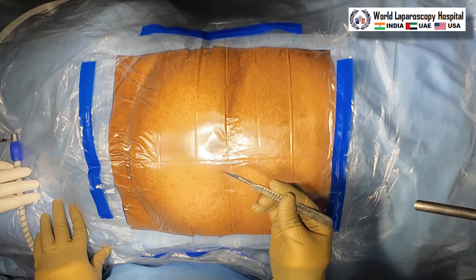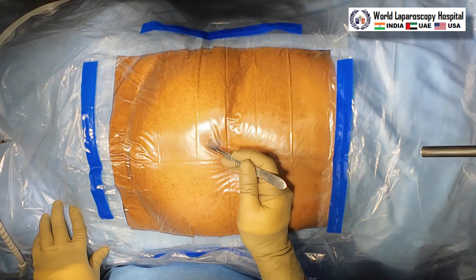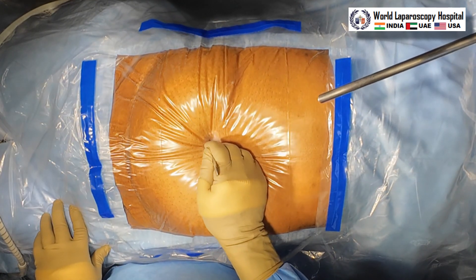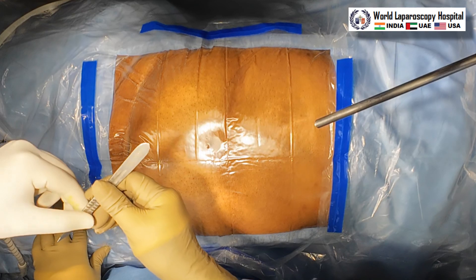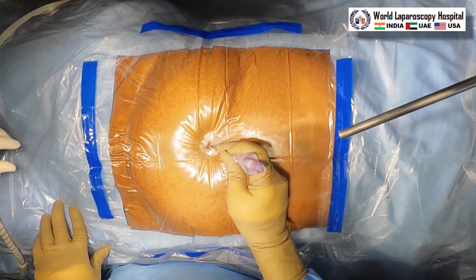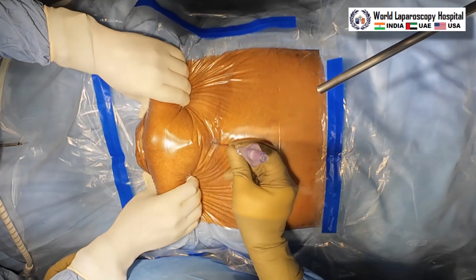Hello friends, this is a case of a simple paraovarian cyst. This is a 10 centimeter left side paraovarian cyst, and this patient has a previous history of appendicitis also, so we will do appendectomy as well.